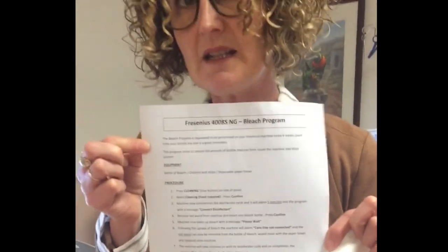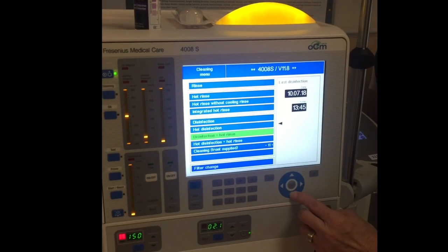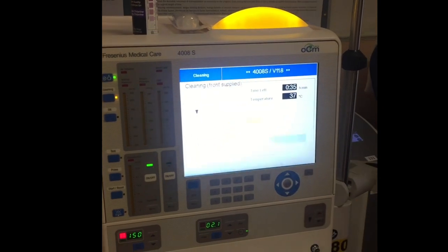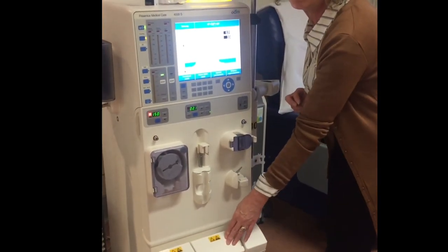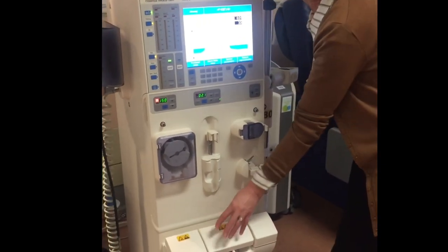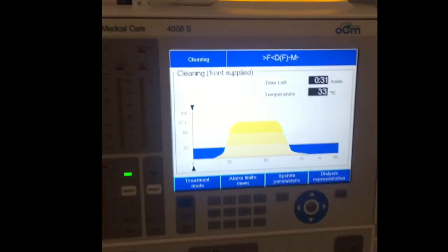I've already turned on the machine. This protocol is all in your machine maintenance section of your manual. We're going to press 'Cleaning' and find 'Cleaning Front Supplied' on the front screen, then confirm. What 'Cleaning Front Supplied' means is that it's going to pick up the bleach from the front of the machine — not like the Citrosteril at the back. This time we get our bleach from the front.